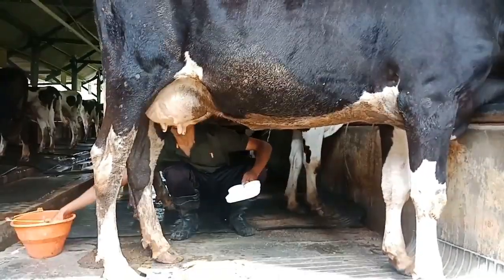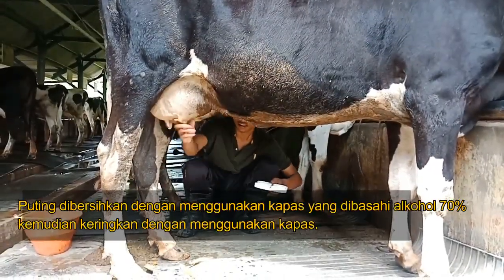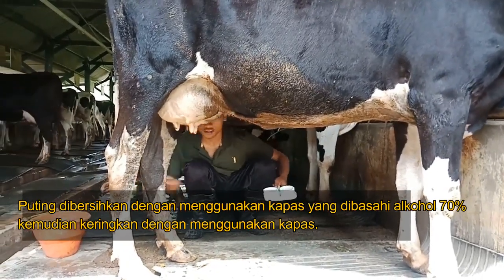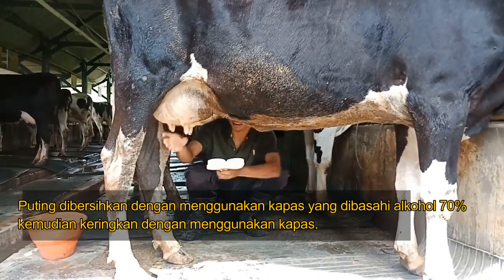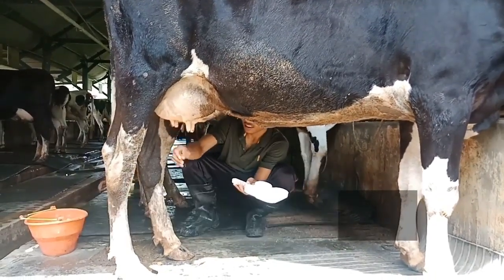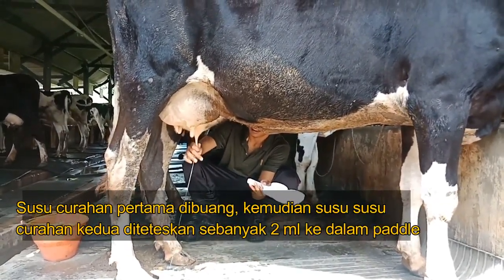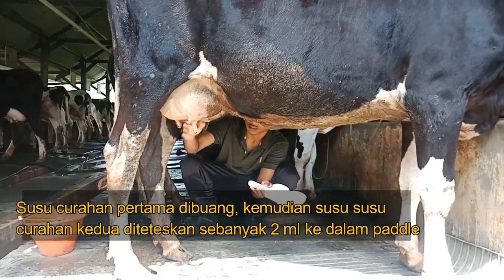Nipples are cleaned using a cotton swab moistened with 70% alcohol, then dried using cotton. The first milk is removed, then the second milk is stripped — 2 milliliters — into the paddle.